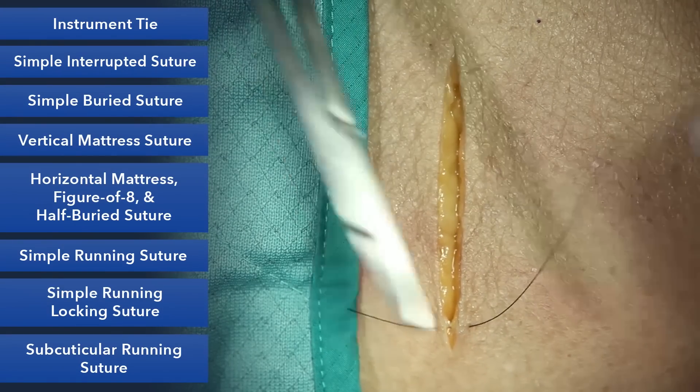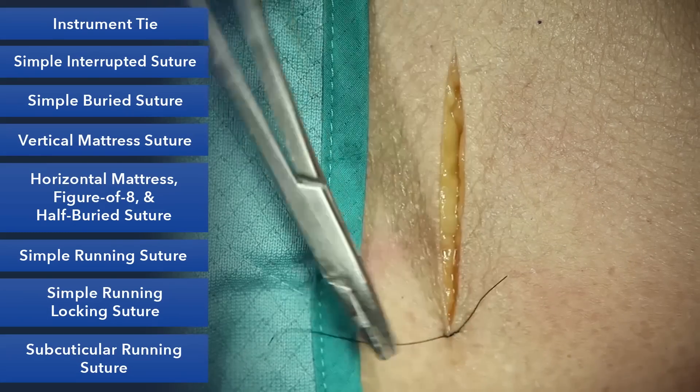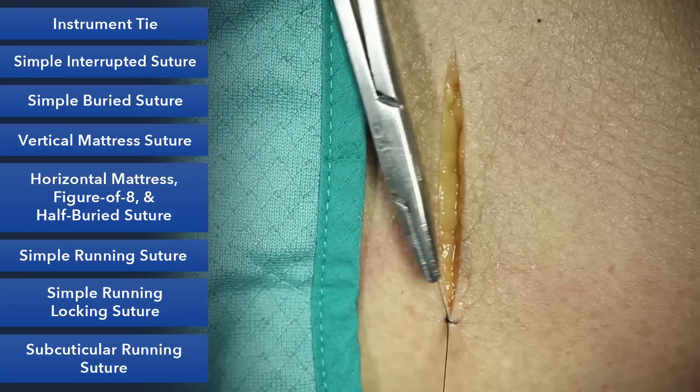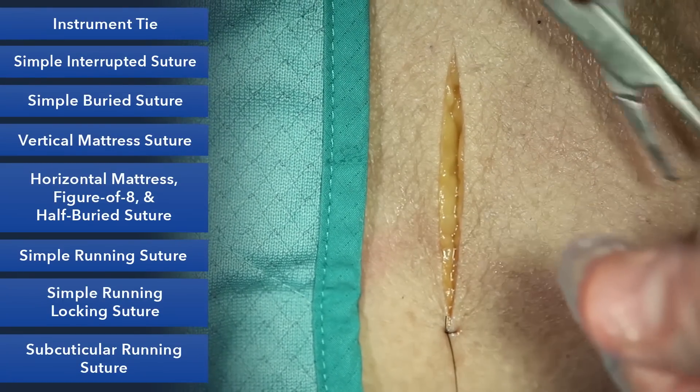You'll start with an instrument tie and try to save length on your suture here. You also want to measure the length of your wound and make sure you're not working with such a long suture that it becomes unruly.